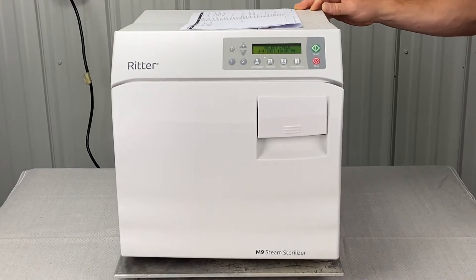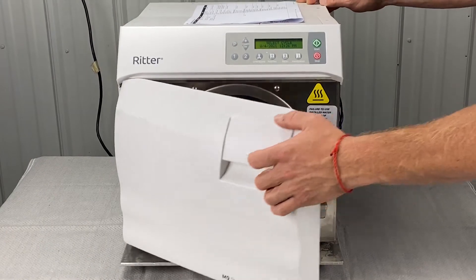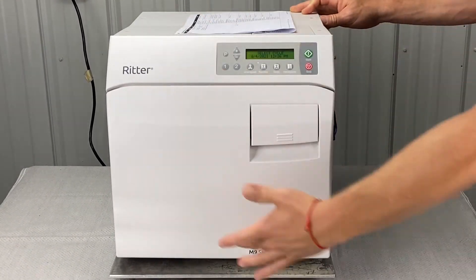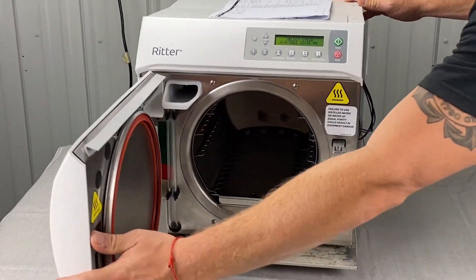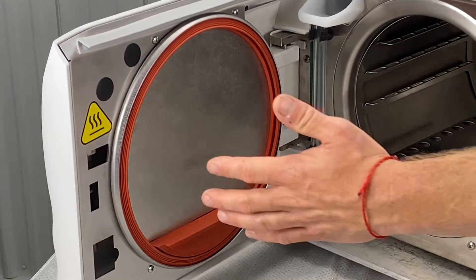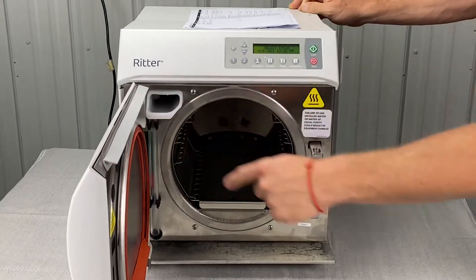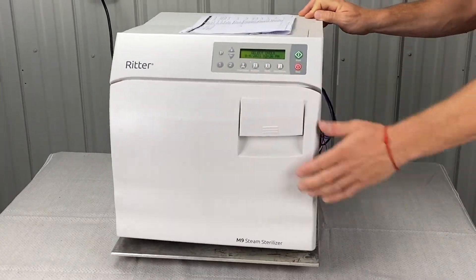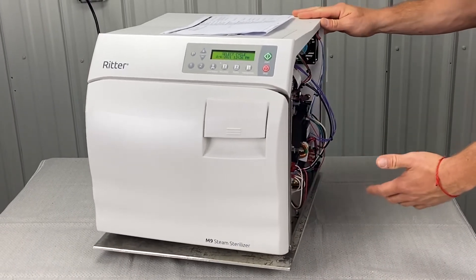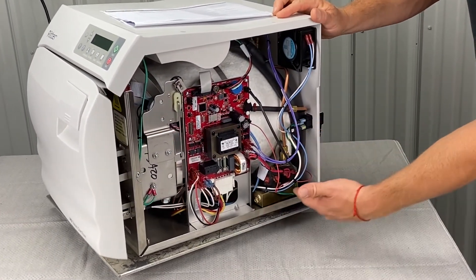The next thing will be pressure leaks. When we pull the instruments out and run an empty cycle, stick around and watch to see if the door gasket is leaking. Make sure it's in place — you want to replace this. It says every year but they don't really last that long. Always have a backup door gasket and dam gasket. Also check for leaks underneath the unit — there could be heating elements leaking or fittings under the belly of the chamber that go to the valves leaking.